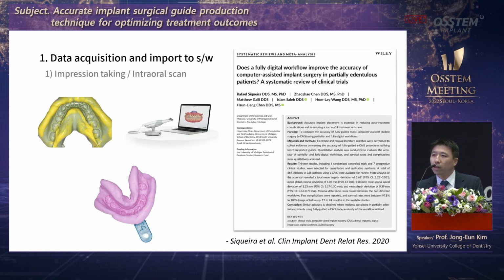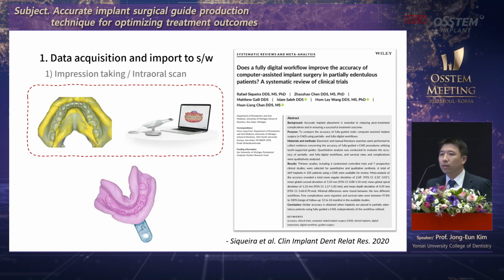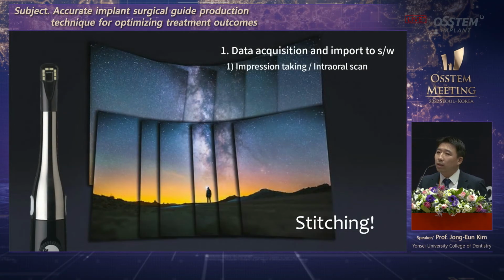First issue is that whether you're going to take impression or intraoral scanning is going to be done. According to a recent review article, it looks into various studies. Taking silicone impression or using intraoral scan. Routinely, we use alginate in this study. The results from alginate were not really optimum. As shown, to get more precise impression, efforts need to be made.